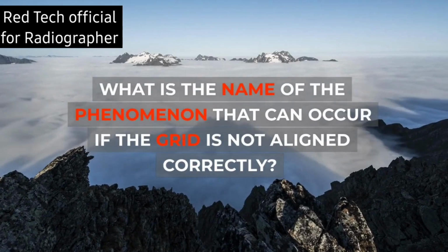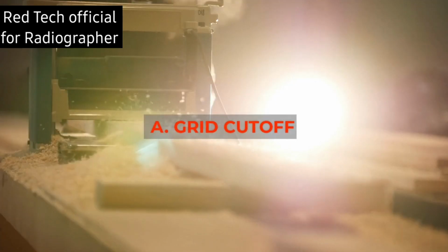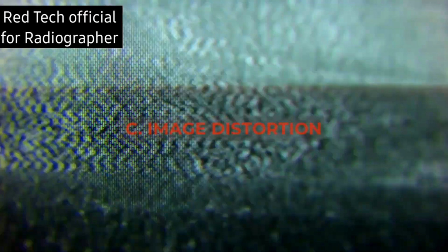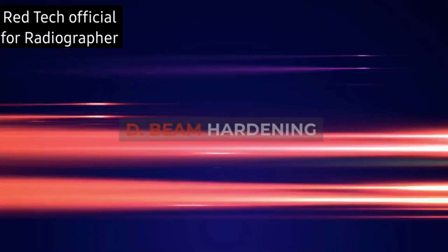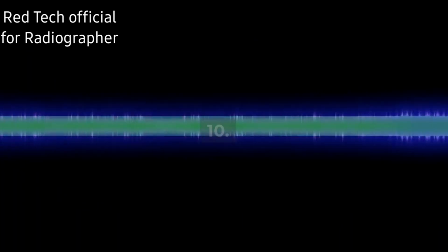9. What is the name of the phenomenon that can occur if the grid is not aligned correctly? A. Grid cutoff. B. Scatter radiation. C. Image distortion. D. Beam hardening. Answer: A. Grid cutoff.